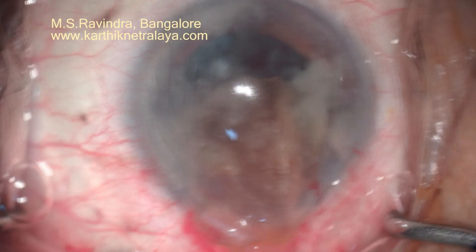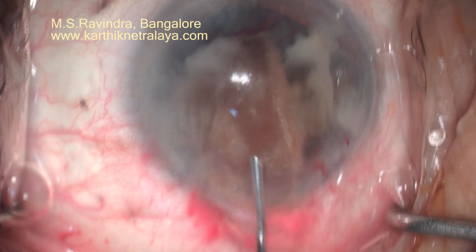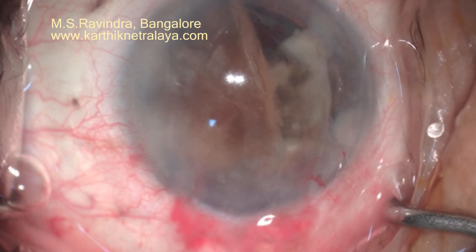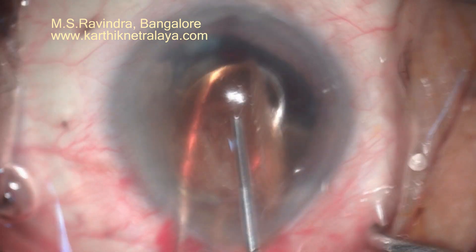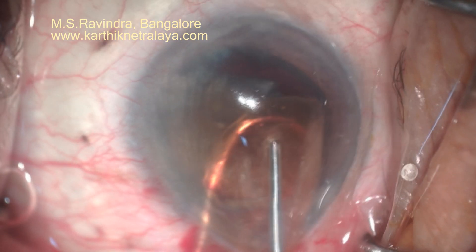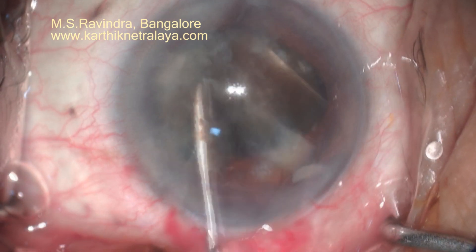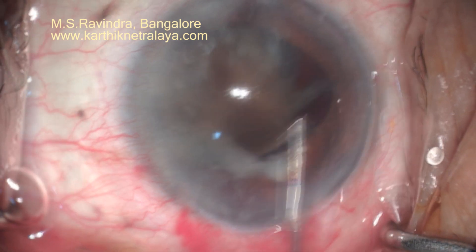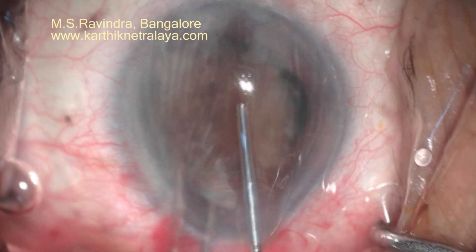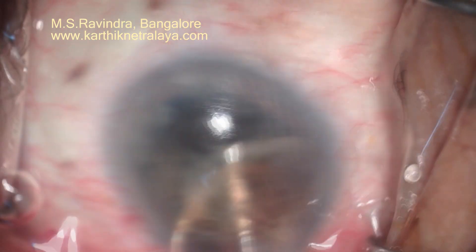I am continuously injecting viscoelastic so that the endothelium is protected against the moving nucleus. It did not come out initially — the tunnel, though larger, is still tight even for a hemi-nucleus. With a larger vectis I could remove it. The other half had gone deeper into the capsular bag, so I positioned it in line with the tunnel and easily extracted it this time.